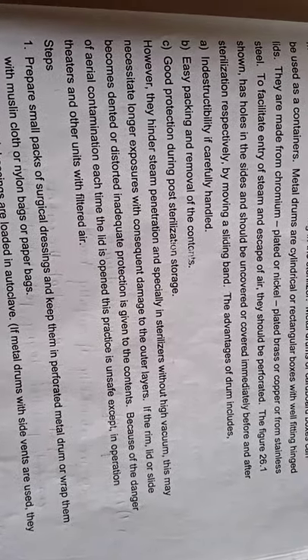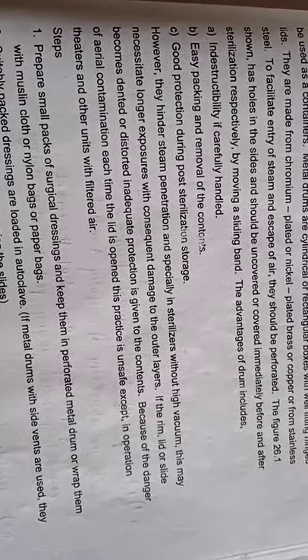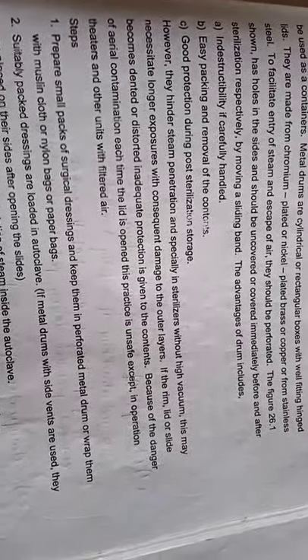The advantages of the drum include indestructibility if carefully handled, easy packing and removal of contents, and good protection during post-sterilization storage. However, they hinder steam penetration, and especially in sterilizers without high vacuum, this may necessitate longer exposure with consequent damage to outer surface layers.